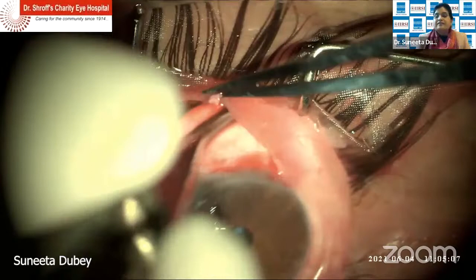Okay, so now, to all the panelists, where would you prefer to put MMC, say, under the conjunctiva or after making the sclera flap? What's your choice to all of you? I use under the conjunctiva. My choice is under conjunctiva. Yeah, under the conjunctiva. Use it after the flap. After the flap. Right. So we got two choices here. We move to the next part.